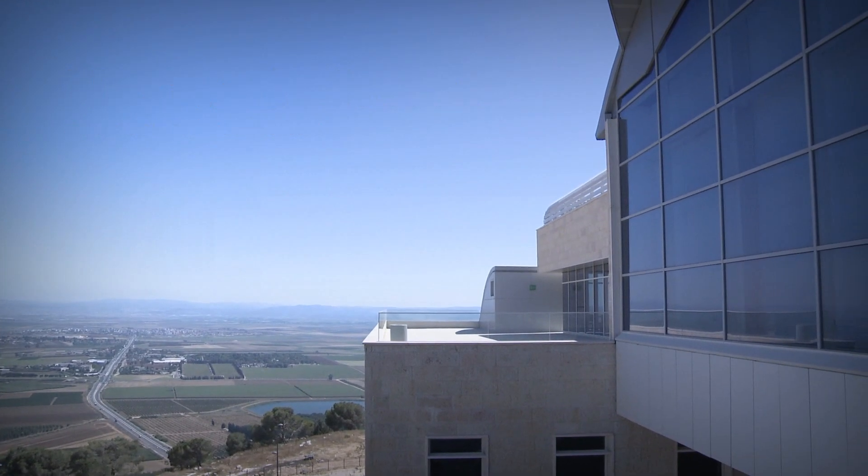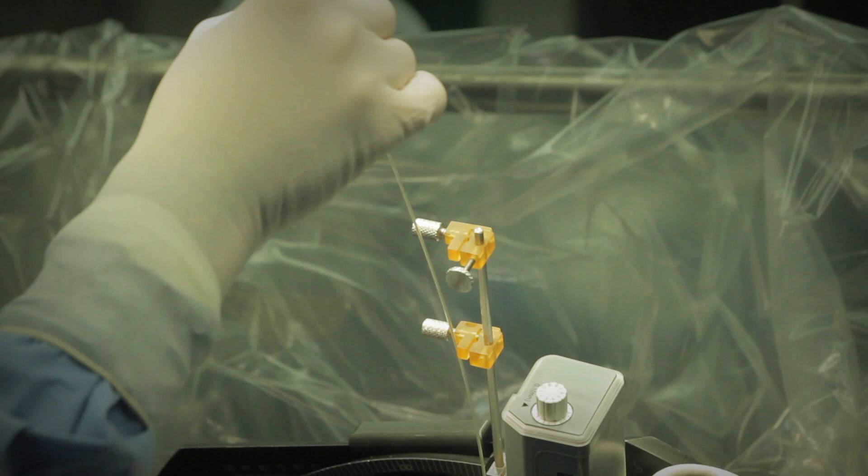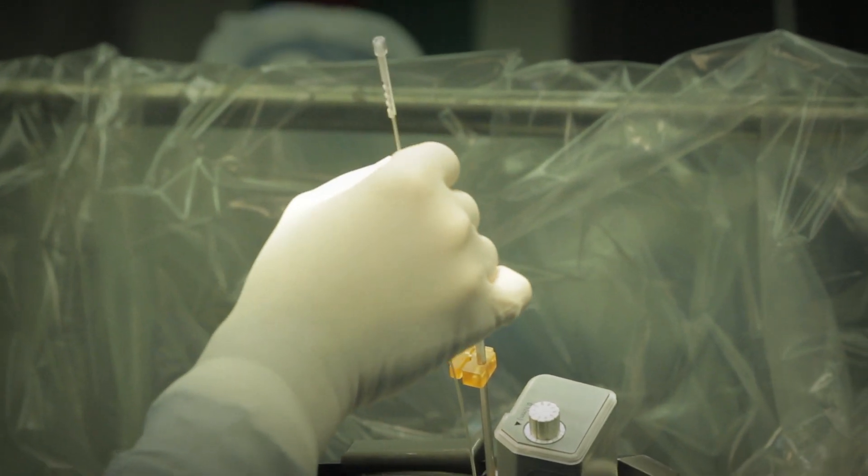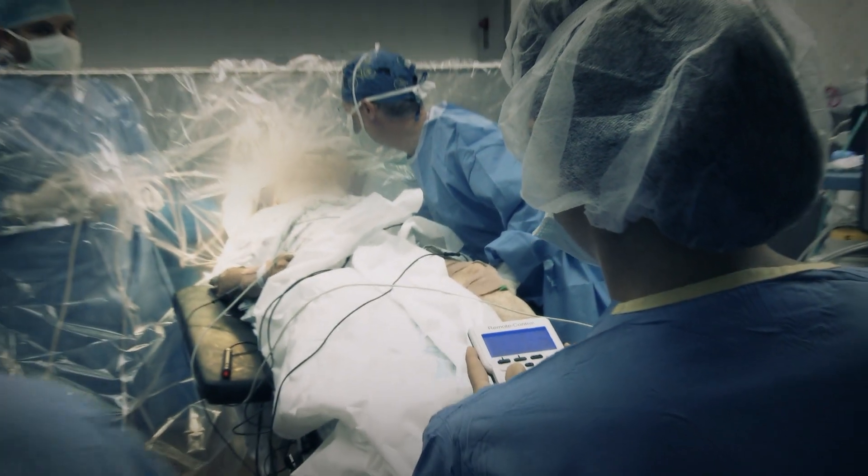Alpha Omega is a medical device company. We have equipment that we use to implant electrodes in the brain to treat people who have neurological and psychiatric diseases. Dealing with the brain you need to be very precise and you need to be in the right and exact point where you give the exact stimulation parameters.